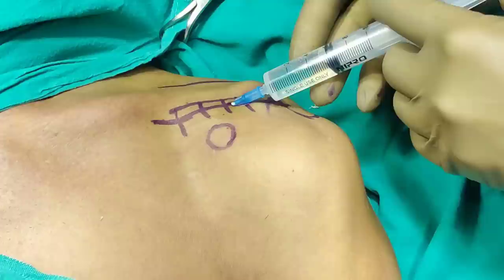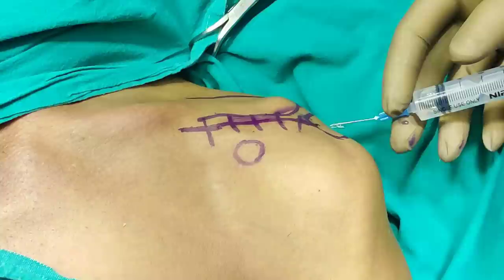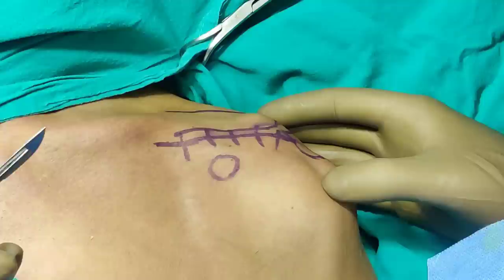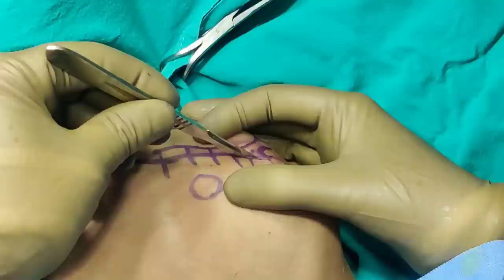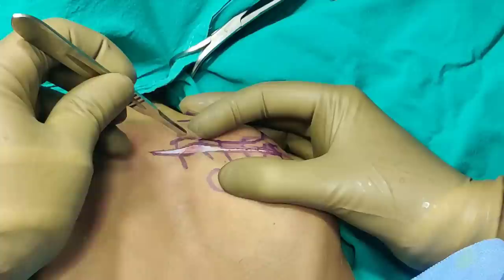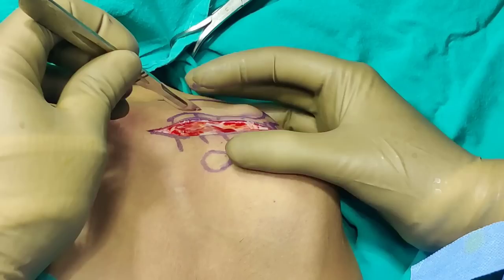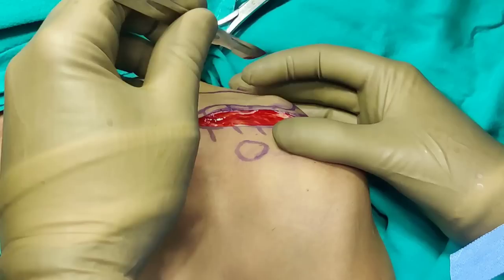When you are dissecting skin or platysma, local anesthetic with adrenaline decreases the risk of bleeding. It comes as a pre-mixed formula and I advise you to use it in areas where you cannot use a tourniquet. After waiting a few minutes, I am going to make my skin incision. There are not many important structures here — just take the skin incision down and keep dissecting in a layered fashion. I will place some self-retaining retractors, do some haemostasis, and then rejoin you.